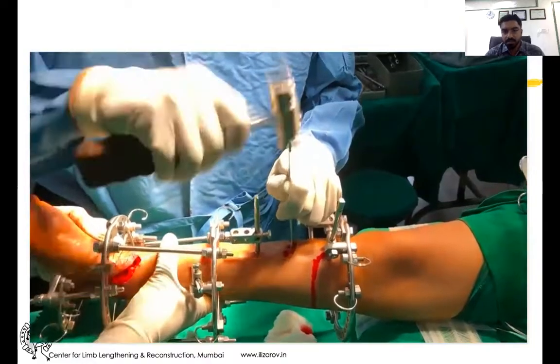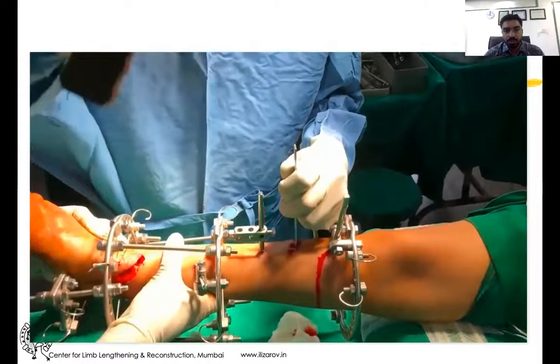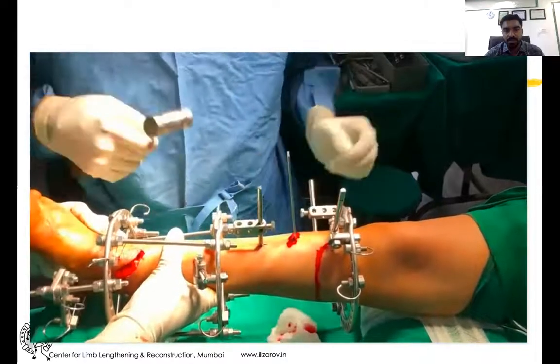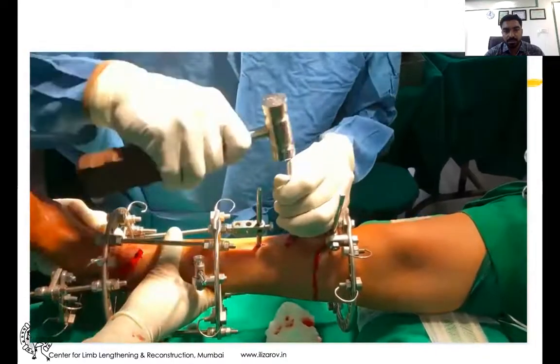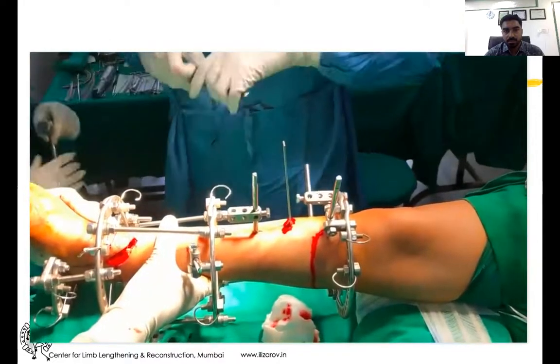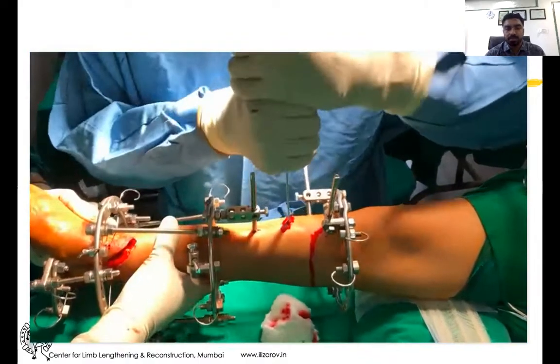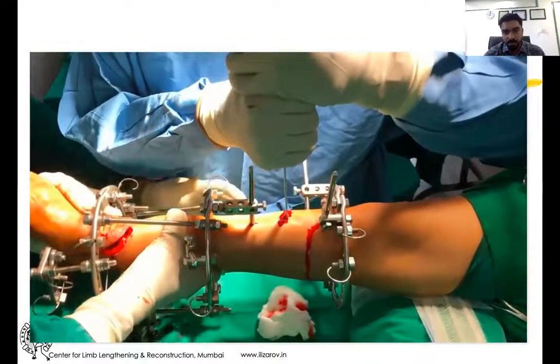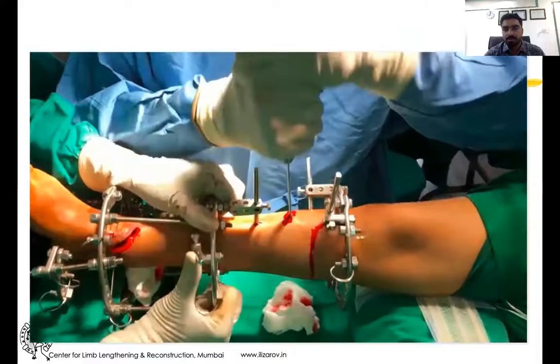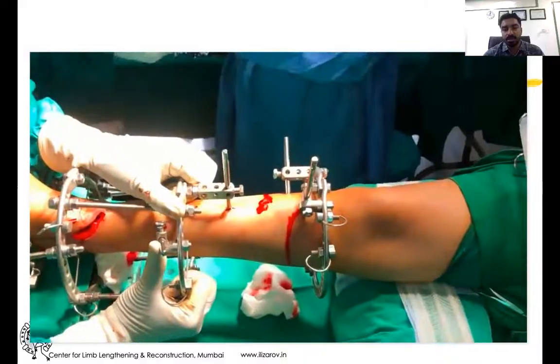Once drilling is done, a sharp 10mm osteotome is used to break the remaining cortices. You need to remove the osteotome in between each break of the bone, otherwise your osteotome may get engaged because the bone has recoil elasticity.